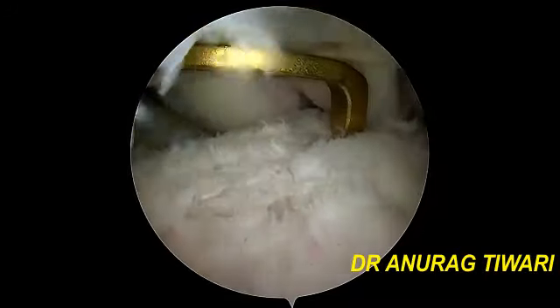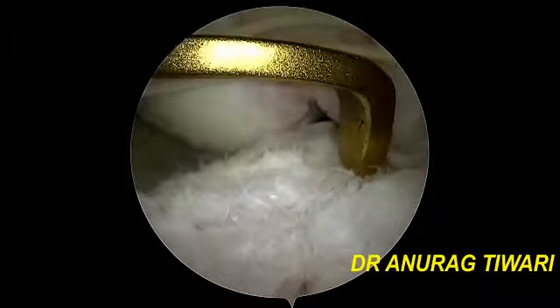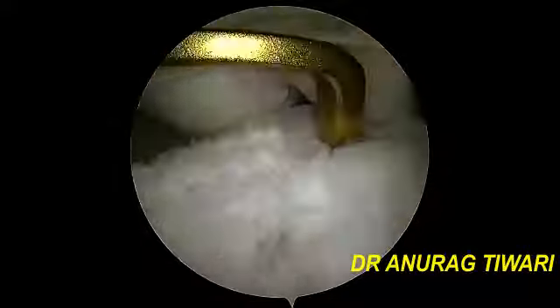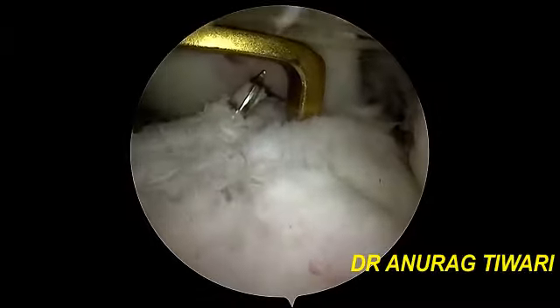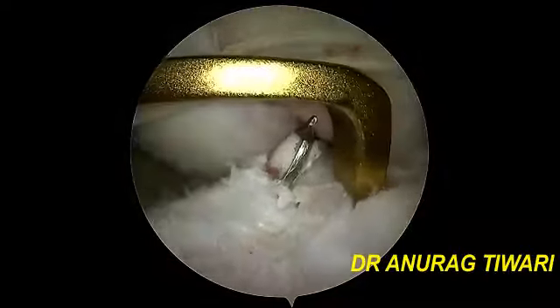So just attach the bullet into this jig and you ream the tibia tunnel with the tibial guide wire, or the bead pin or K wire can also be used. So this is the guide wire. So the position is correct. I am satisfied with this position, so I will just confirm this.